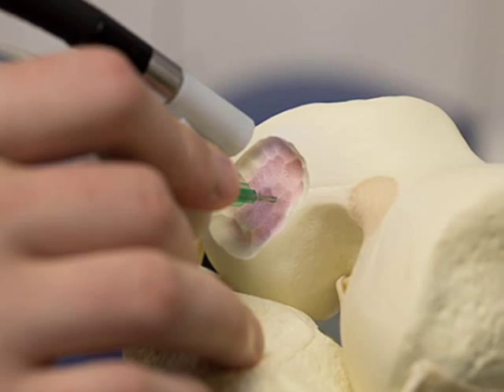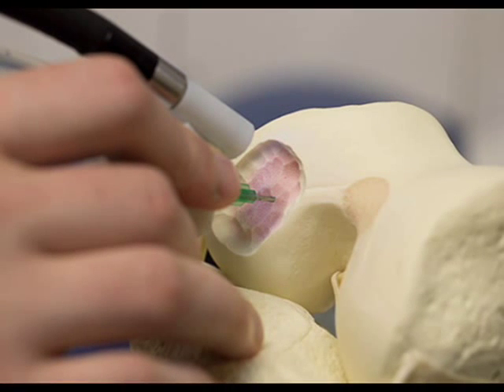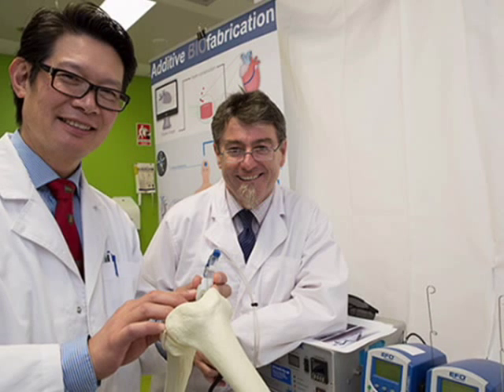Once the cells are drawn onto the surgery site, they will multiply and become differentiated into nerve cells, muscle cells, or bone cells, eventually turning from individual cells into a thriving community of cells in the form of functioning tissue, such as nerves or muscle.